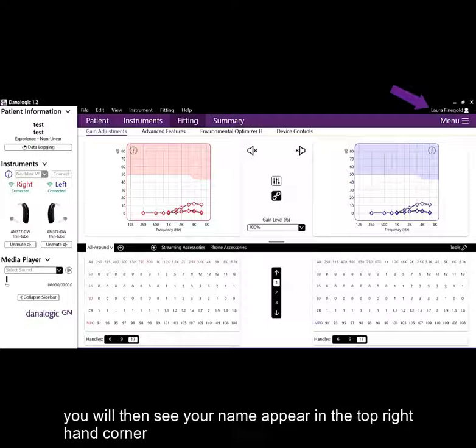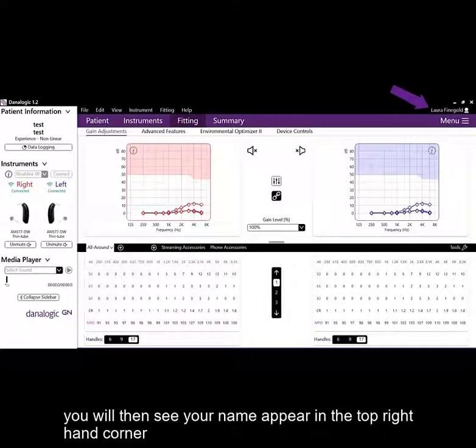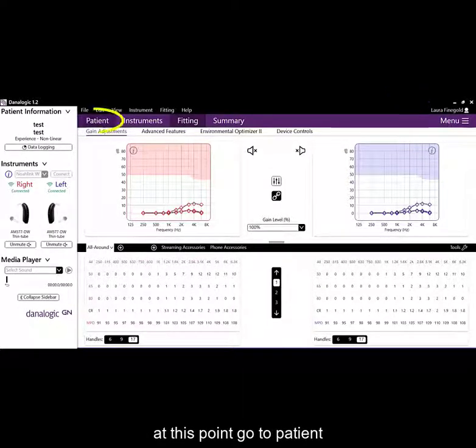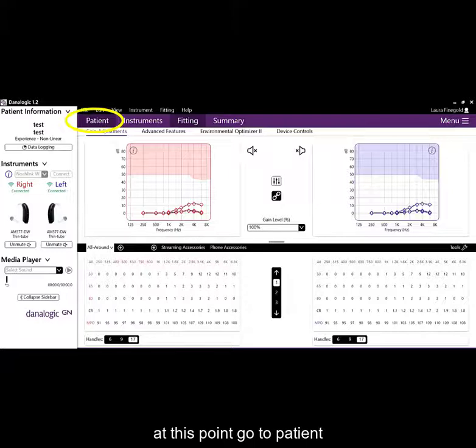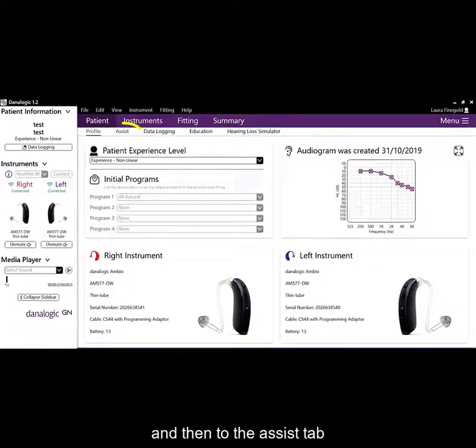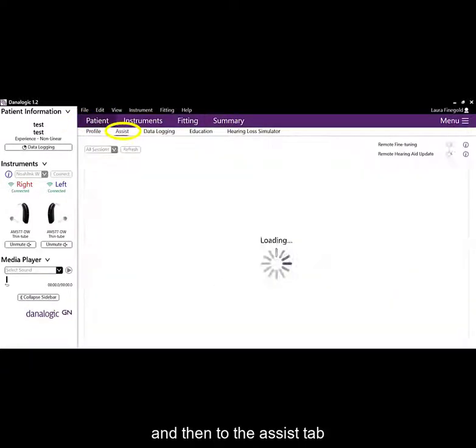You will then see your name appear in the top right hand corner. At this point, go to patient and then to the assist tab.